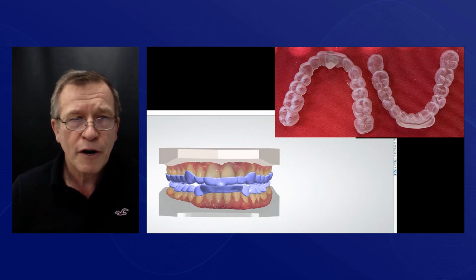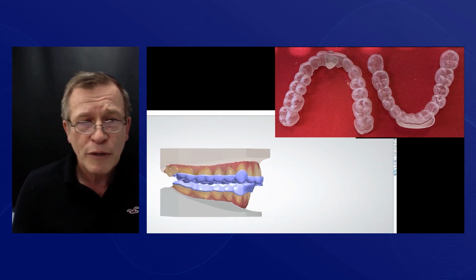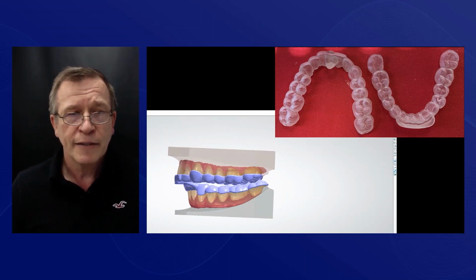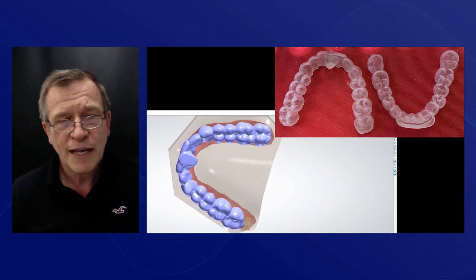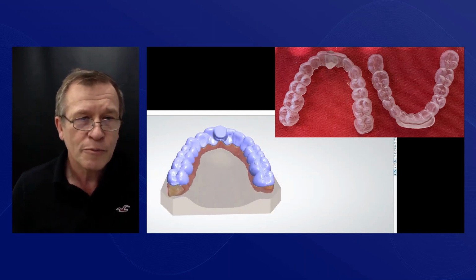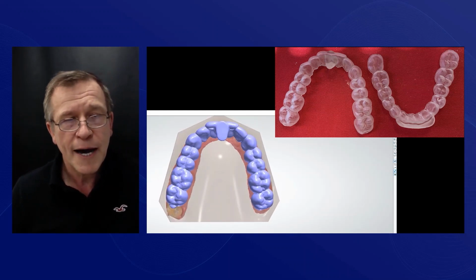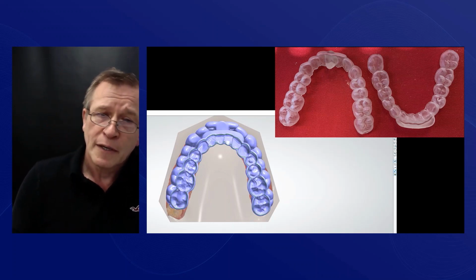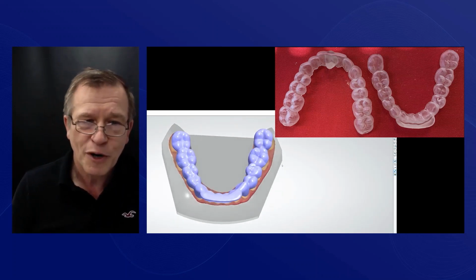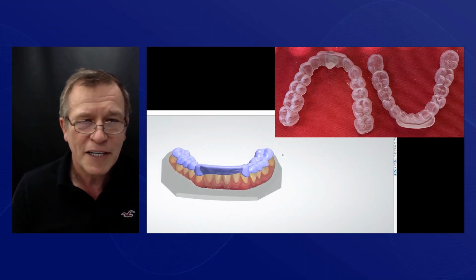So, very often with someone like Gordon, we might need to stabilize the bite first. And making splints, well, that was a pain in the neck for me for a lot of years. We would have to take all those models and mount them, use acrylic. It was smelly and horrible and not very nice for anyone.